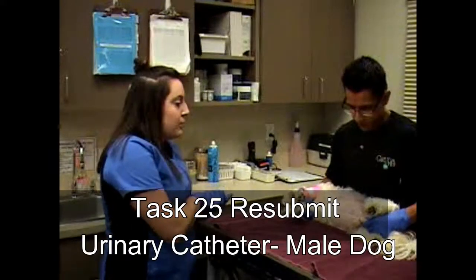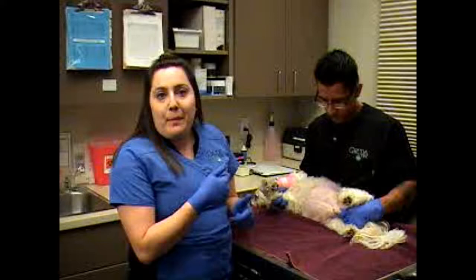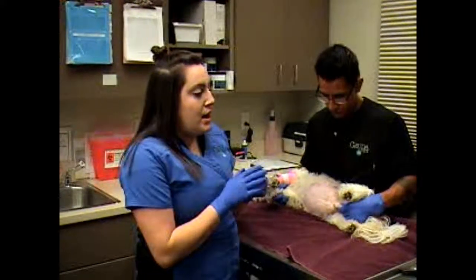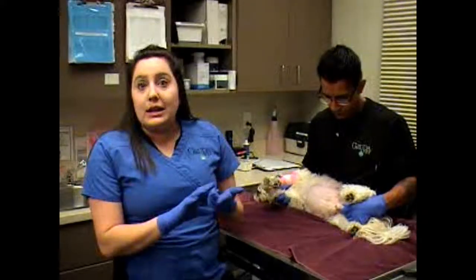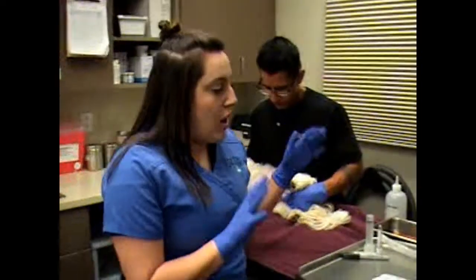Duke here in lateral recumbency. Juan's just holding him in lateral. We're going to extrude that penis and then cleanse it before we put in a urinary catheter to collect a urine sample. First thing, we'll just go over all of our supplies here.